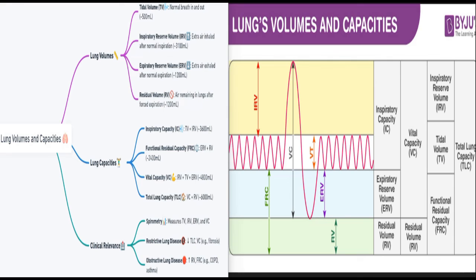The maximal rate, when we talk about peak expiratory flow rate, is the maximal rate that a person can exhale during a short maximal expiratory effort after full inspiration, and is measured with peak flow meters. In patients with asthma, the peak expiratory flow percent predicted correlates reasonably with the percent predicted value for the forced expiratory volume in 1 second. So the peak expiratory flow provides an objective measure of airflow limitation when spirometry is not available.